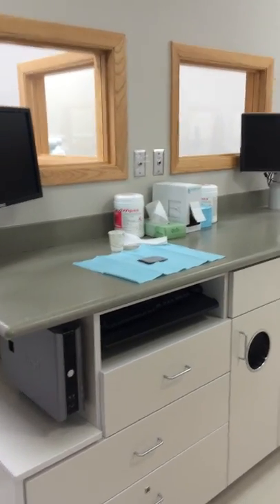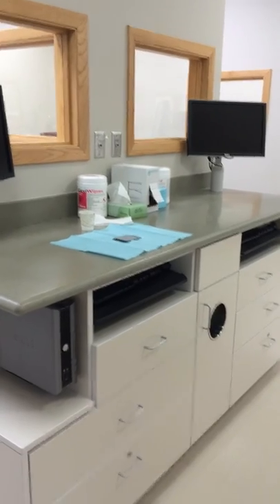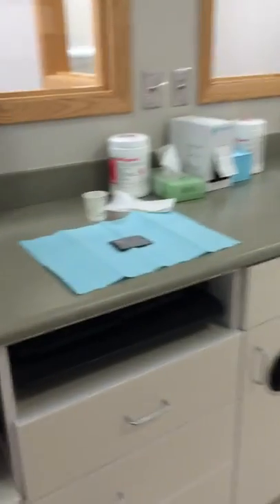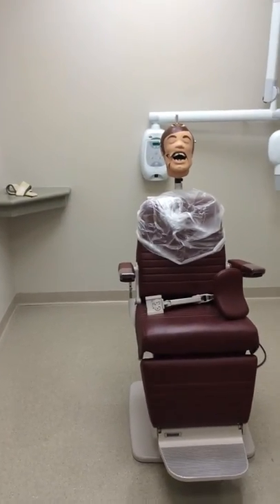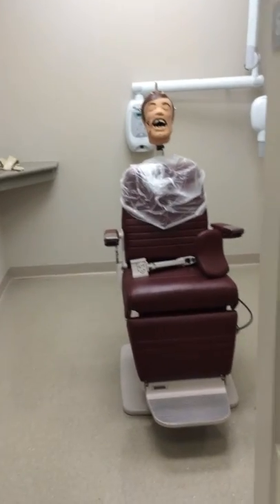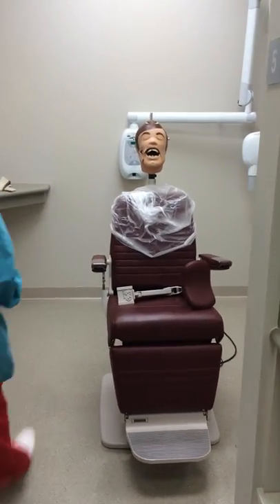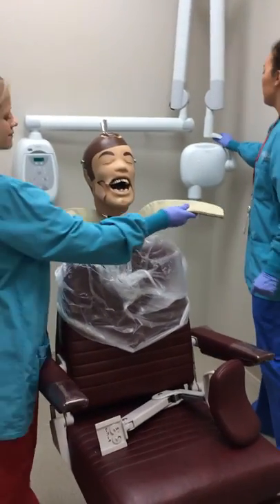Today we will be demonstrating a maxillary anterior occlusal radiograph. Start by obtaining a size 4 phosphor plate and setting up your room as shown. A round PID will be used for this type of radiograph. Prep the patient by having them remove any glasses or dentures and placing the thyroid collar around their neck.